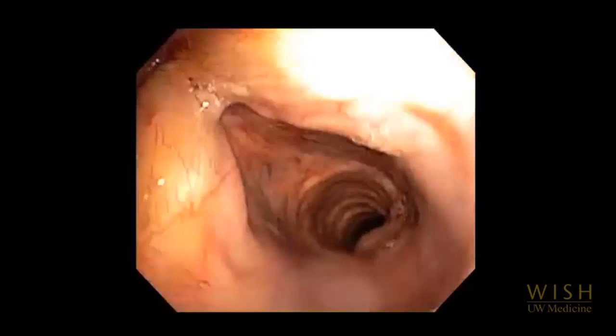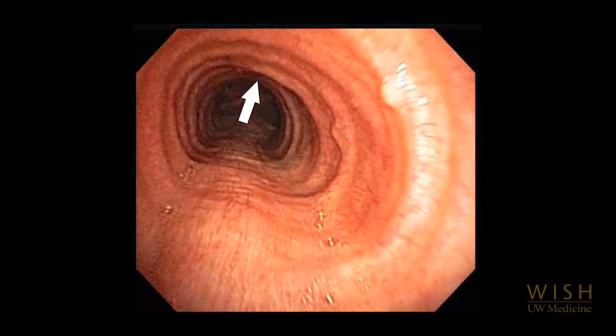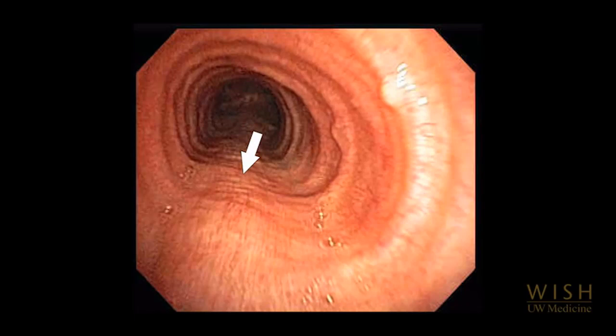Orientation within the trachea can be determined by the characteristics of the tracheal walls. The anterior wall has cartilaginous rings which maintain its curved shape. The posterior wall is membranous with longitudinal striations and collapses with coughing.